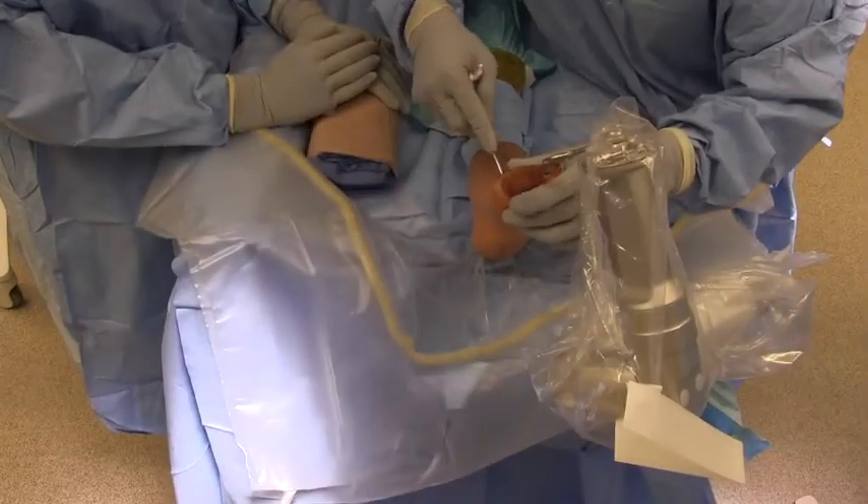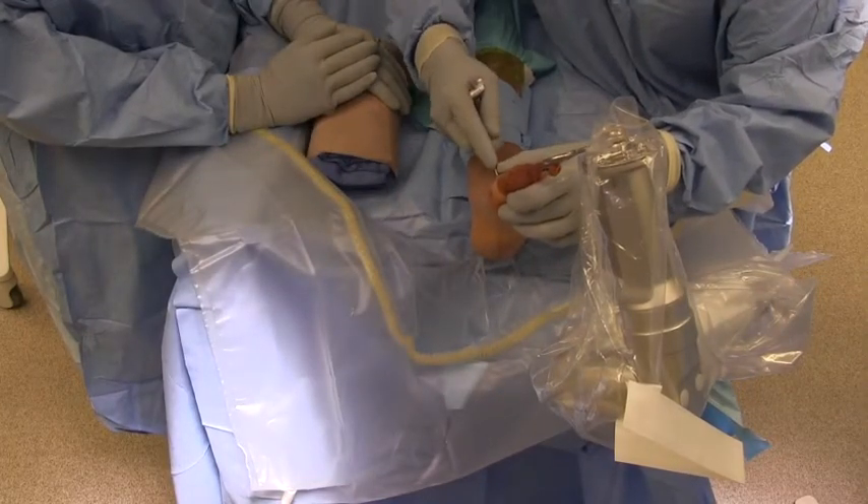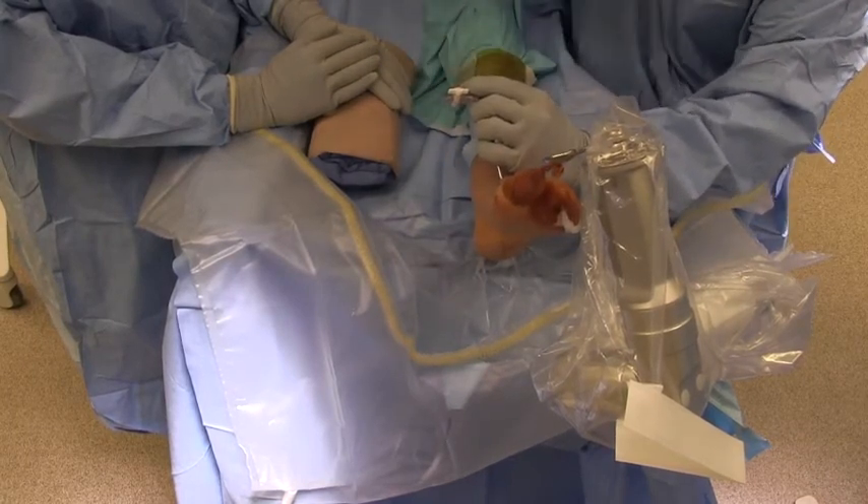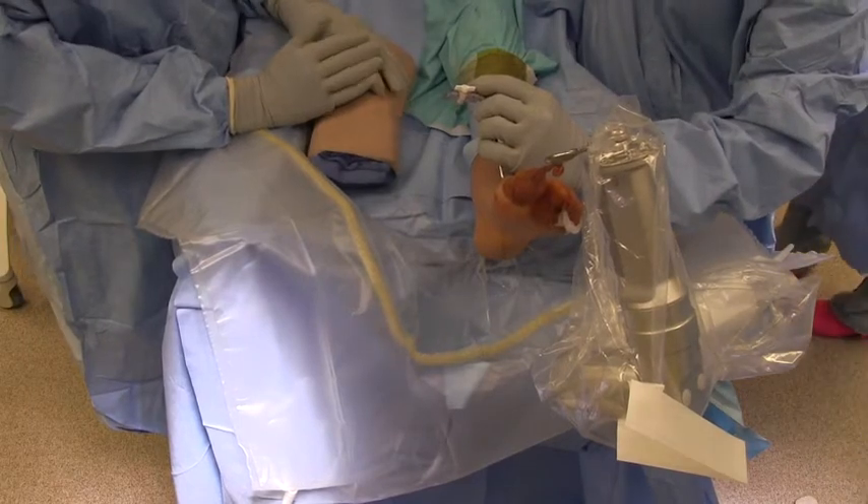A 1.9mm flexible tipped arthroscope is then placed in the first MTPJ to allow for great visualization of the nonunion site, as well as diagnostic arthroscopy of the first MTPJ.